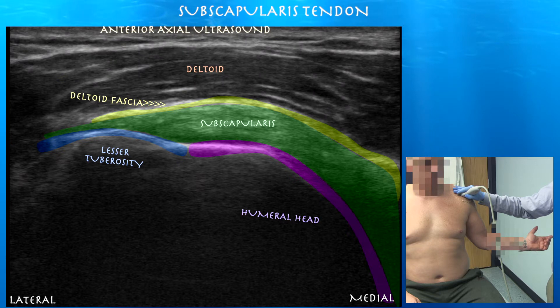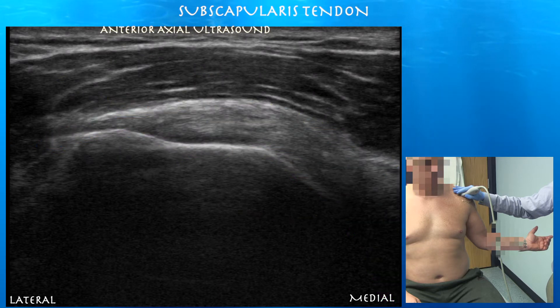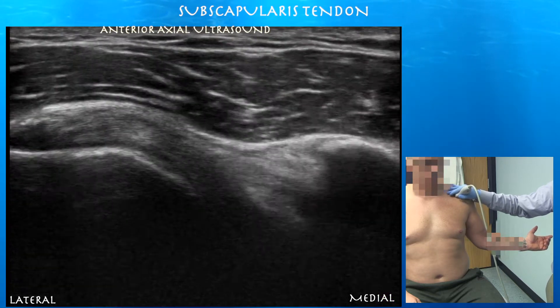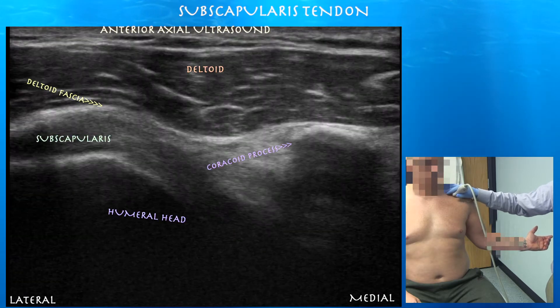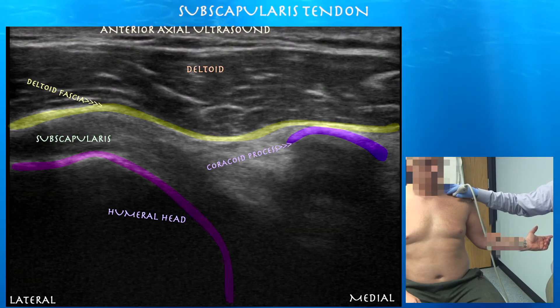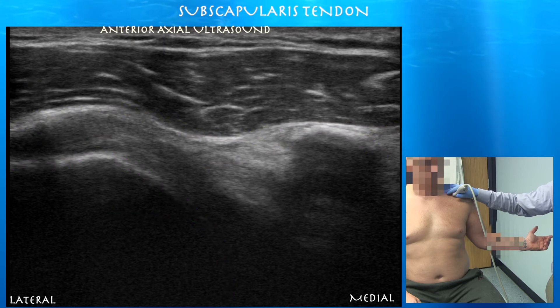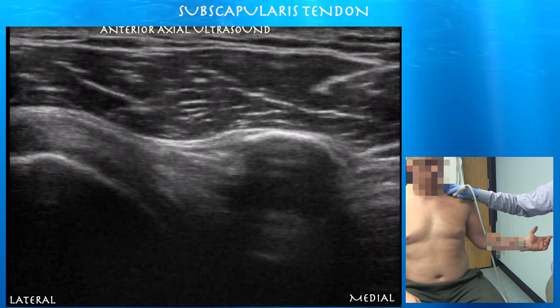We're looking at the subscapularis tendon inserting on the lesser tuberosity. Right side of the screen is medial. Here you can see the subscapularis tendon as it glides under the coracoid process. Sometimes you can get a bursitis where the tendon rubs underneath the coracoid.